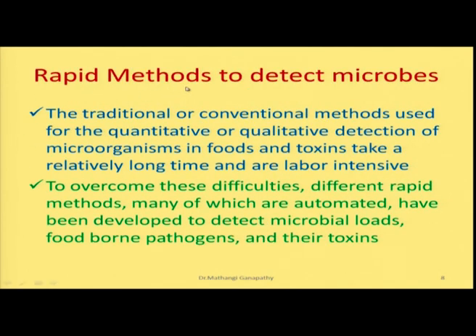Let's see the rapid methods to detect the microbes. The traditional or conventional methods used for the quantitative or the qualitative detection of microbes in food and toxins, all these take a very long time.